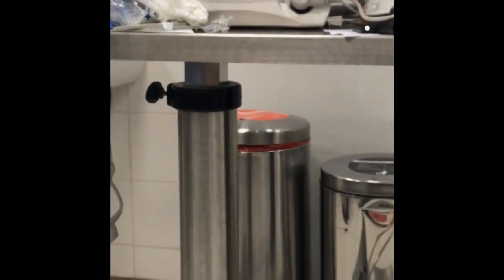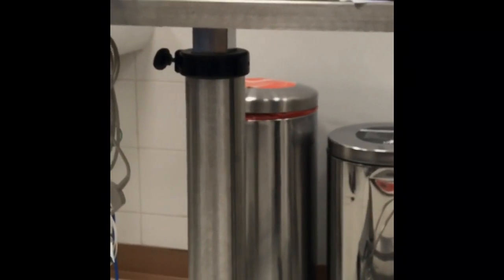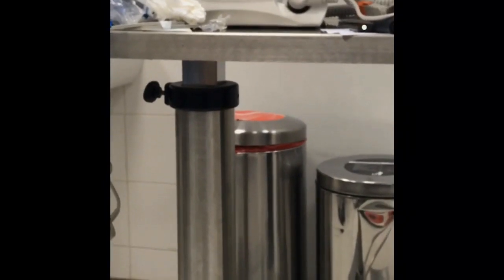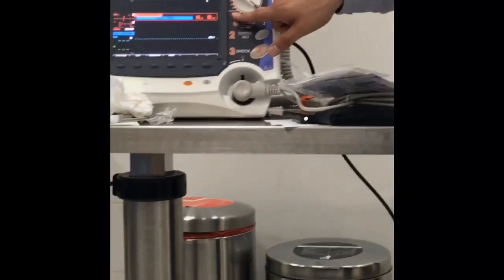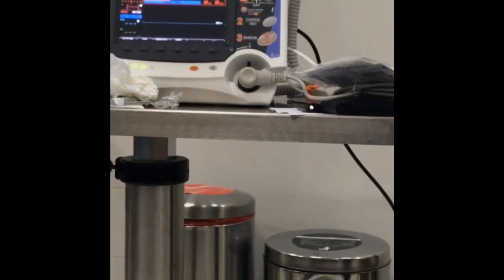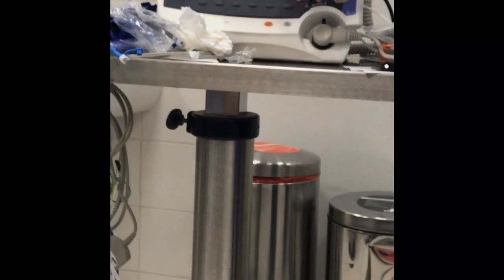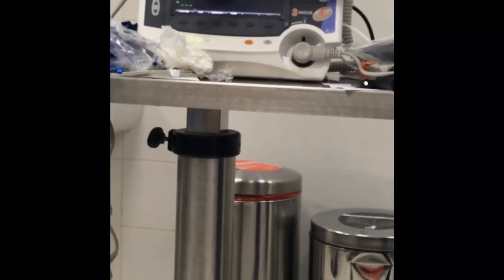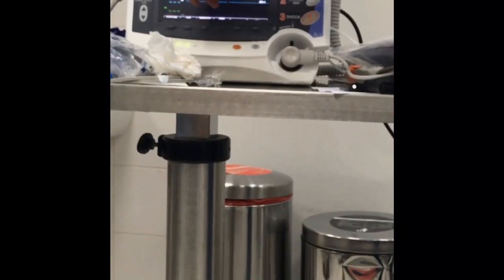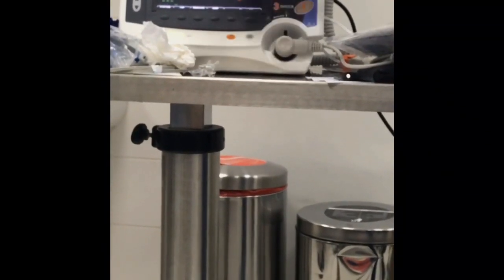What he meant is, let's say the heart rate of the patient has dropped to 39. This will give the shock automatically to start increasing the heart rate of the patient. Always watch the ECG heart rate, not the pulse rate, when you do the pacing, because it will not add up here, but all with the ECG.